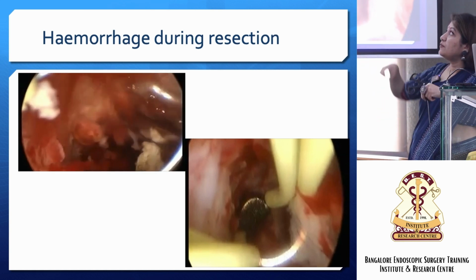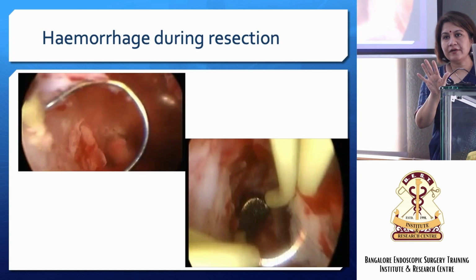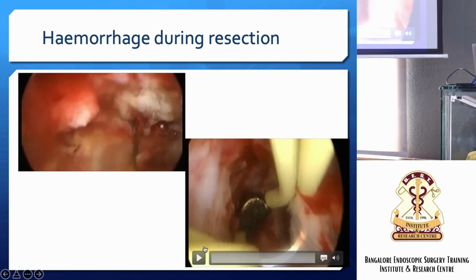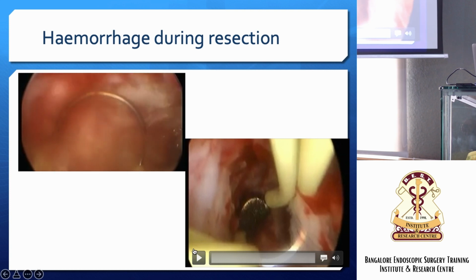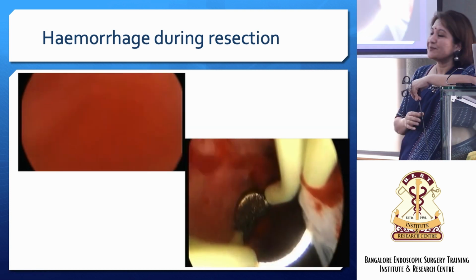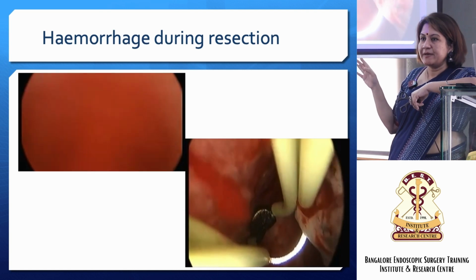Then I used a ball. This is only to demonstrate ball cautery. But ultimately, she settled down only with embolization. This is temporary. These are all from 2016-17 when I was beginning my journey. Of course, this balloon can be done. So this is one way.